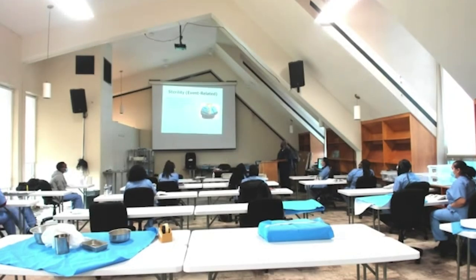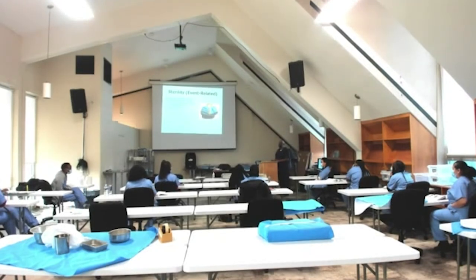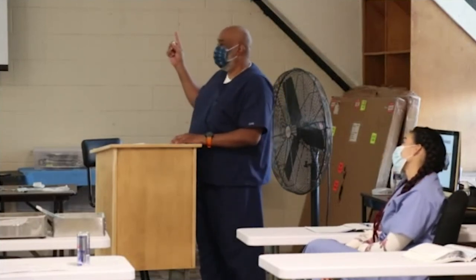All right, I got a situation here, and you guys got to help me out. This is the last one. This one doctor, he insists he has to have it, right? This is Dr. Lazar, he's a terror, and he says, I want to use it. We're solution oriented, so I want you to think outside the box. What can we do? We can wash it and then sterilize it. He needs it now. He needs it right away. Think. We're not going to give them that as it is, but is there a way that we can still use that and give it to him?